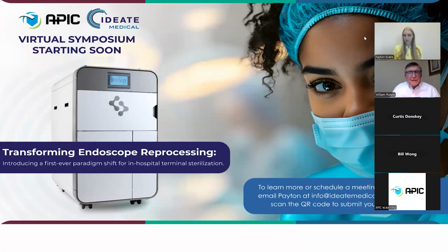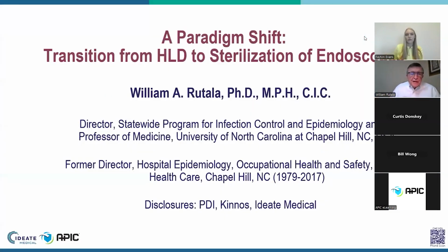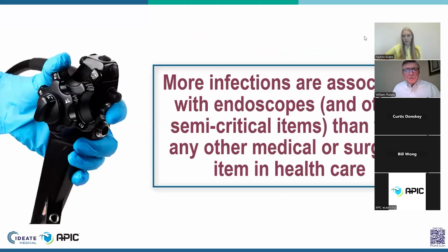In the next slide, of course, the topic is the issue of a paradigm shift from doing high-level disinfection of flexible scopes to sterilization. In the next slide, we're going to essentially identify what I think most of you know, and that is more infections are associated with flexible endoscopes than any other medical device in healthcare.